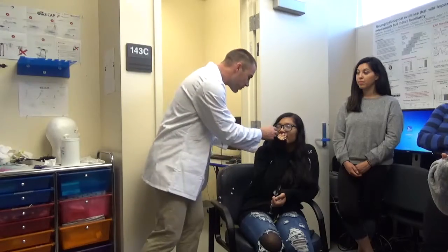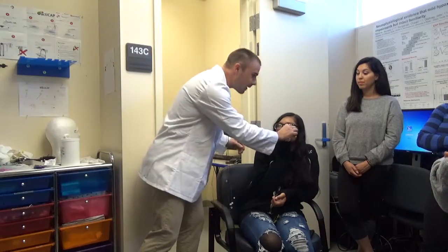So he's sitting here, just like Stormy is, just kind of hanging out, and the other researcher just goes about his business and says, okay, yeah, I'm going to do this. And he starts cleaning off the site, and doesn't realize that because Nick had just come out of practice, he had all these scrapes on his face. And he puts this alcohol right in the open wounds, right?